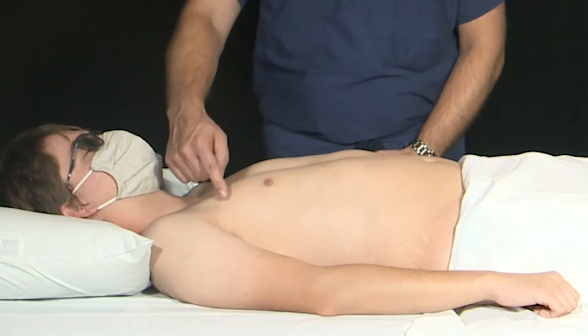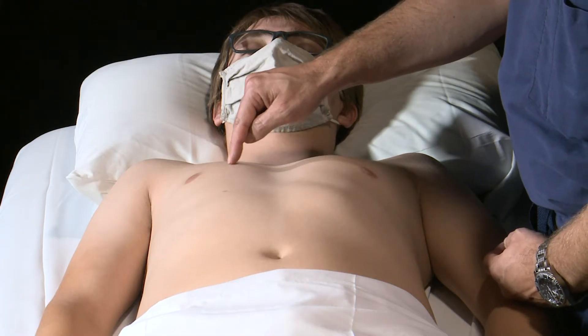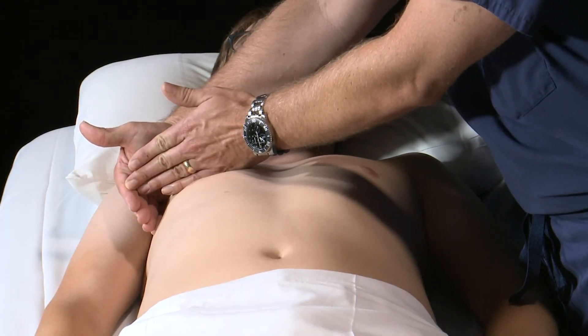The second protocol we are going to use is the one traditionally used for someone who is short of breath or in whom we may suspect pulmonary edema. This is known as the 8-zone protocol, or more popularly described as Volpicelli's protocol. In this lung imaging protocol, we are going to draw two imaginary lines — the first along the anterior axillary line and the second just above the nipple all the way over laterally. These two intersecting lines will essentially make four zones on each side of the chest.